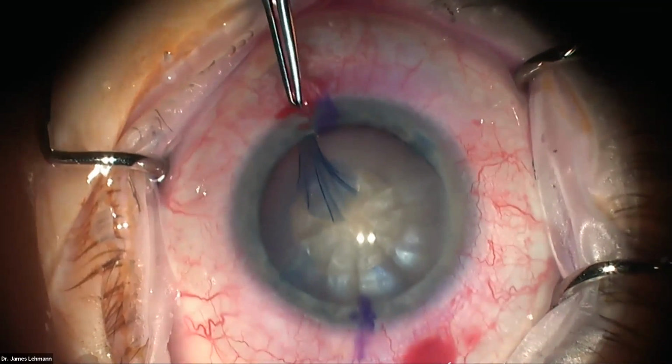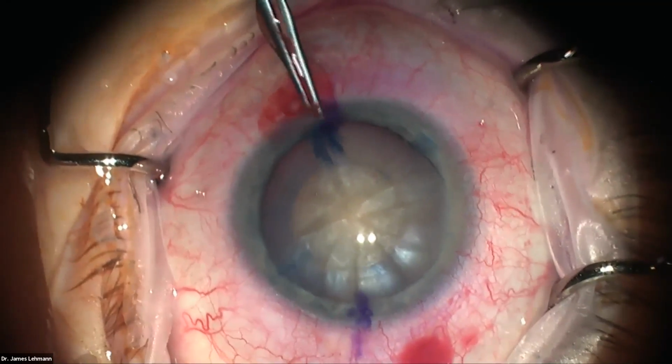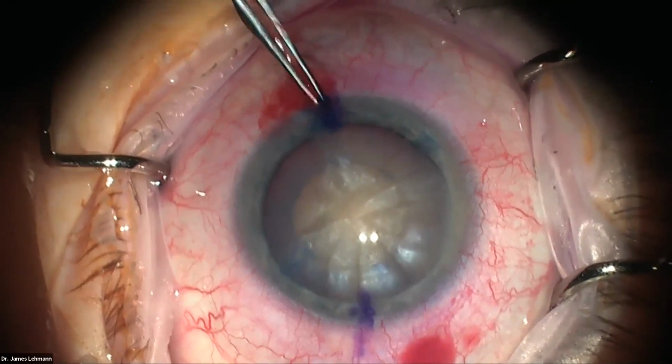Okay, and everything went nicely there. So we have a nice 360 Rhexis. Sometimes it's tricky to grab that. And we'll just remove that from the eye.